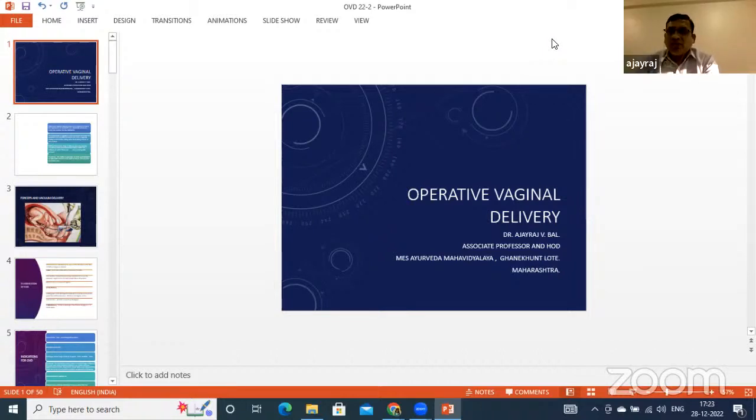There is a knob. There are two knobs. One on the vacuum machine also. You can adjust the pressure from 15 to 20. That is sufficient. In some cases, you may require up to 25 also. It is calibrated from 0 to 30. So the pressure should be around 15 to 20. If you see that the pressure is increasing, or the machine is not calibrated, there is one kind of screw knob placed at the zero side of that manometer, and we can adjust the pressure with that knob.